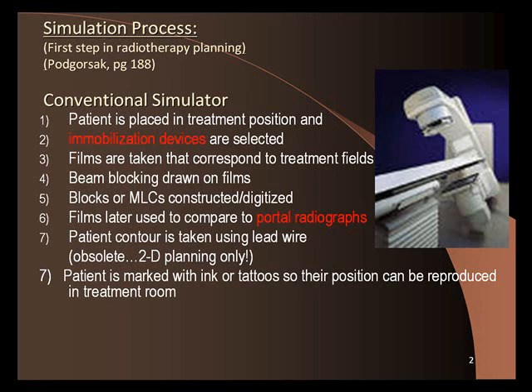They'll put the film down on the block cutter, of course it's flat horizontal, and the pointer is pointing this way, and they'll trace these blocks out. Okay, and they'll cut these holes in pieces of styrofoam, and then we'll pour Cerrobend in here. Okay, and when that hardens up, these get mounted onto an acrylic tray, and that tray gets mounted into the head of the machine. Okay, and then these block the radiation.